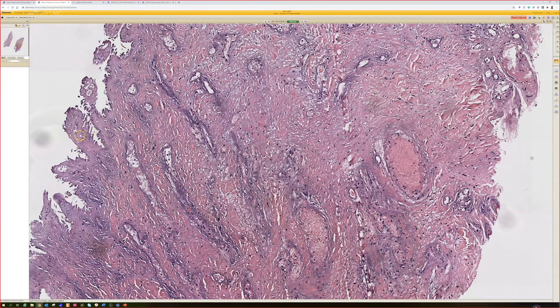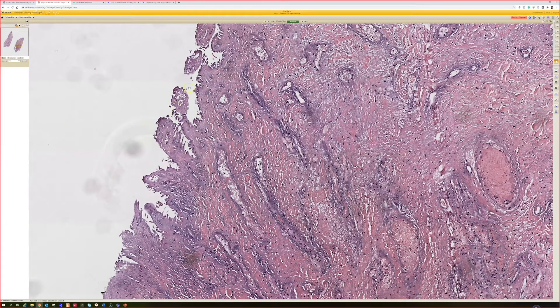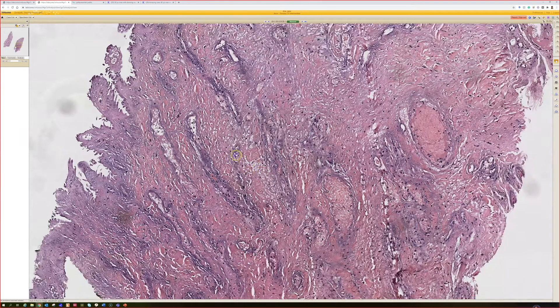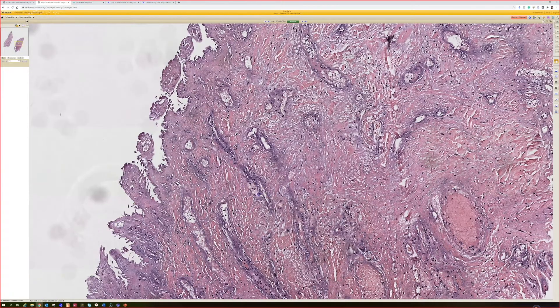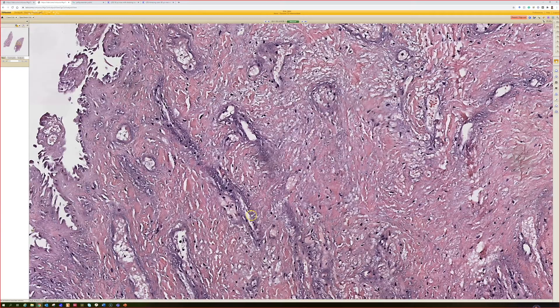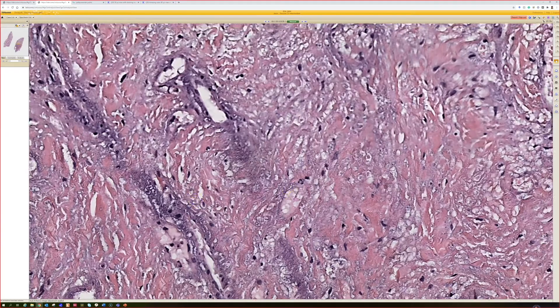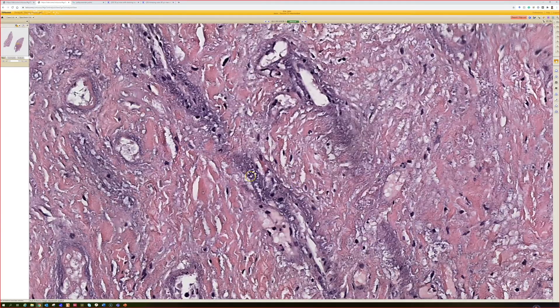This tissue is on its way out. The epidermis has died enough that it detached, broke free, and sloughed away. The dermis looks like it is on death's doorstep, and the vessels are surrounded by that thick blue coat of Pseudomonas aeruginosa bacteria.